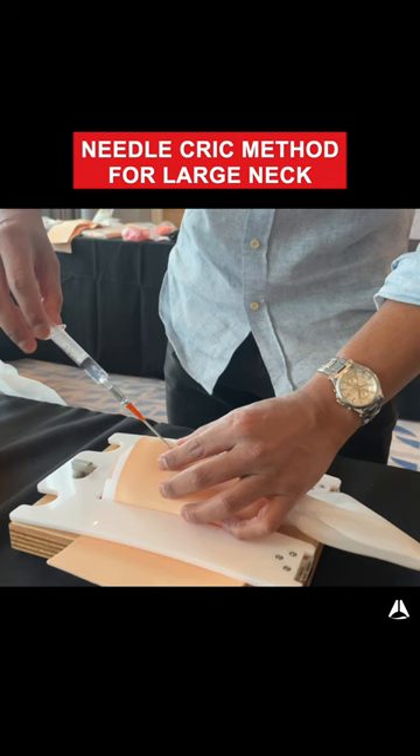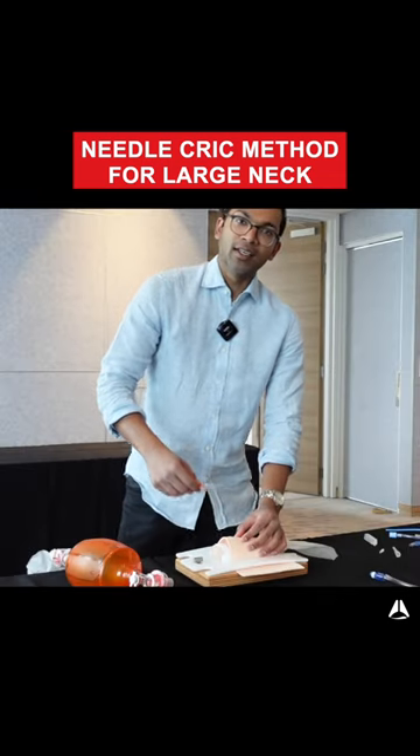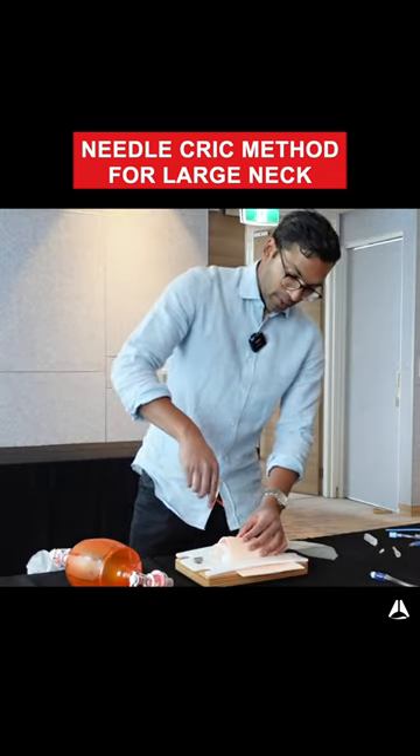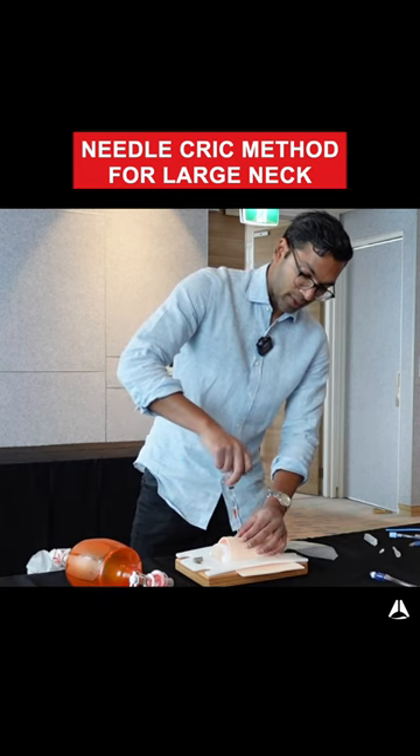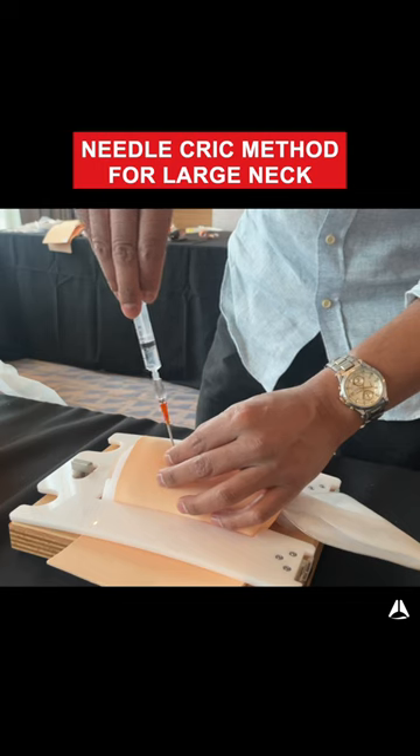I don't get the aspiration of air, and that's all good. So now I know that my trachea is going to be deeper. I might want to do some more vertical incision so I can actually reach the trachea. I might start in the midline and let's say that fails.